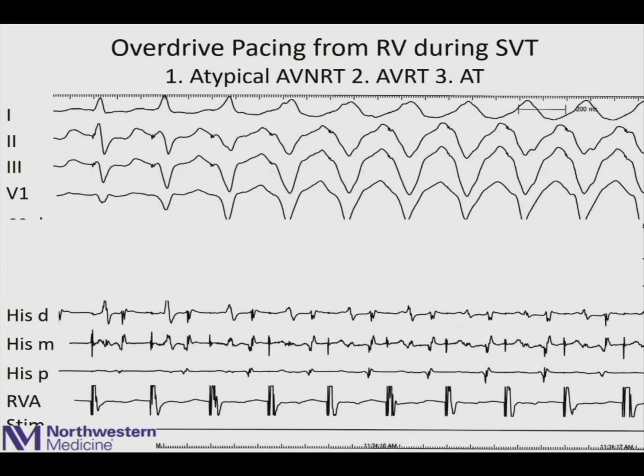And then this is my last slide showing this transition zone that Jeff alluded to, which I think when you're dealing with a long RP tachycardia with concentric atrial activation, and you can't tell, is this atypical AV node reentry or is this a slowly conducting accessory pathway, the best maneuver is to look at what happens when you start pacing and you entrain it. And if you pace properly, as we talked about, and you get progressive fusion like this, then look and find out when the first atrial electrogram is that's pulled in.